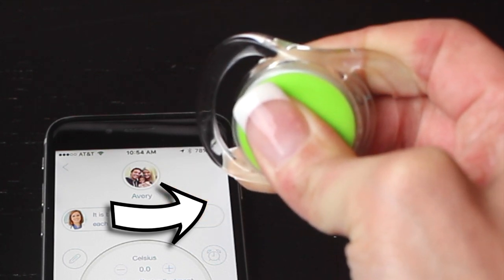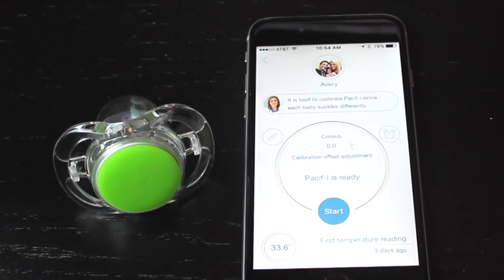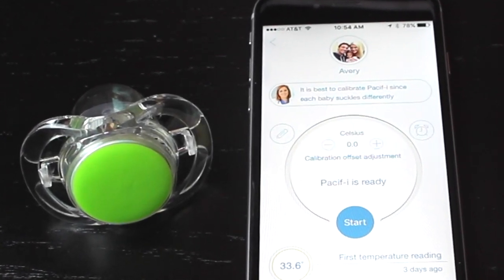To turn the pacifier on, just press the middle button in the center of the pacifier. If you look at the app, it'll tell you when Pacify is ready. Then give your baby the pacifier and let the readings begin.